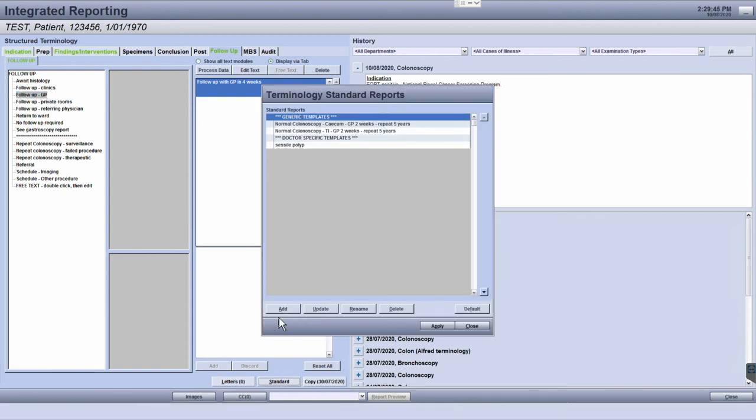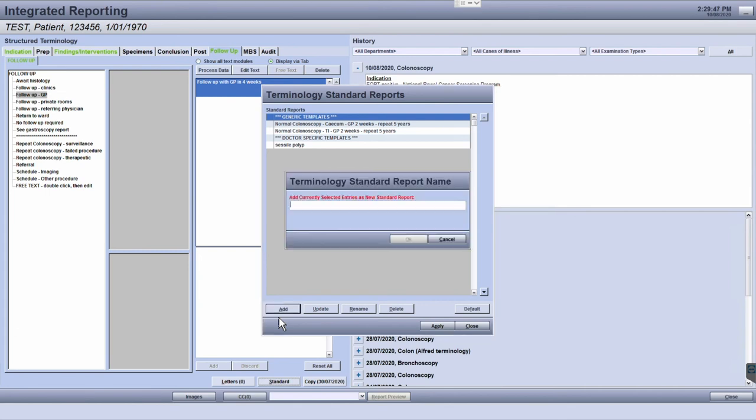Now click add to add the current report. Add a name to the report and then press OK to save this in the list of standard report templates. This should now be available as a selected template.